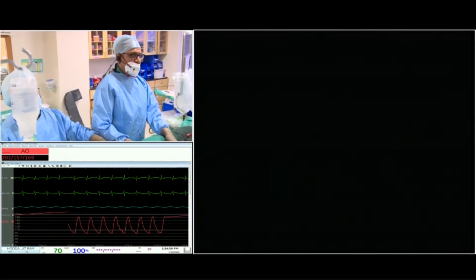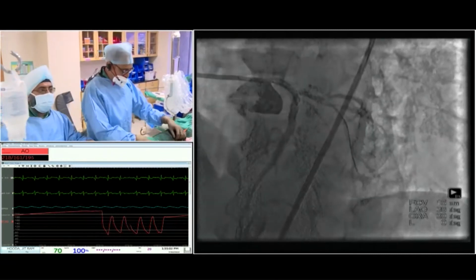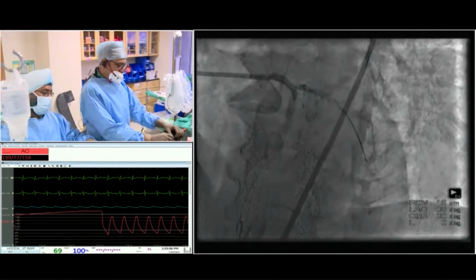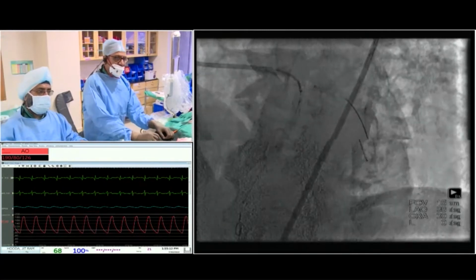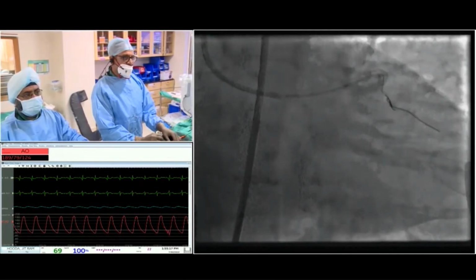But I want to stay clear of the ostium. If you are not doing it, you can check it on ultrasound also, IVUS. Yeah, looks pretty good. Go to caudal. Okay. And I have seen that the ostium of the circumflex is clean on IVUS. So that gives me a lot of breathing space where I deal only with the ramus.